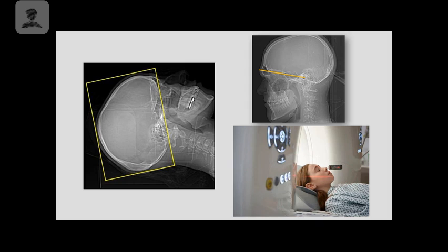I can't see the actual laser light for the up and down inside of the gantry. In my opinion, they should be raising the table up a little bit further for this patient. They're kind of centered more anteriorly. But as far as aligning, we want to make sure that we have this SOML, so that's supraorbital meatal line, and we want it to be perpendicular to our table.